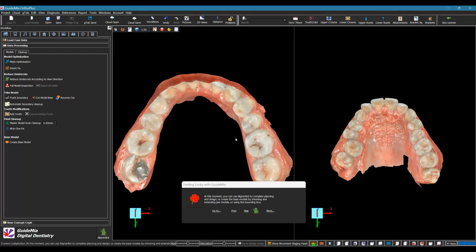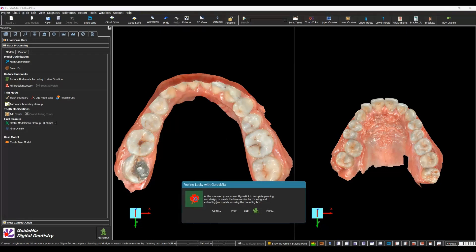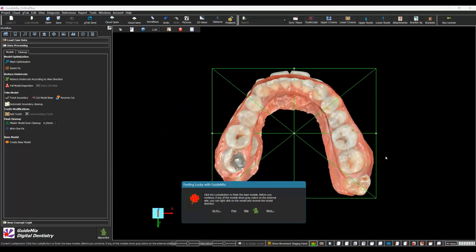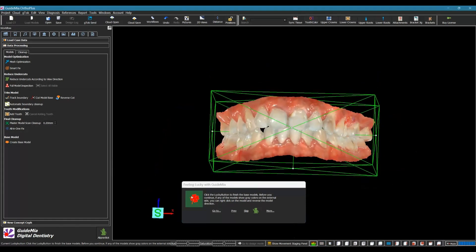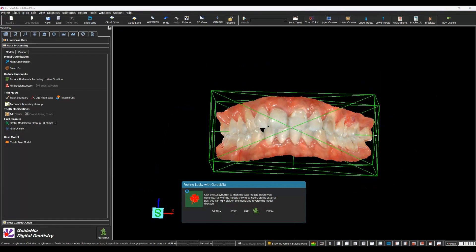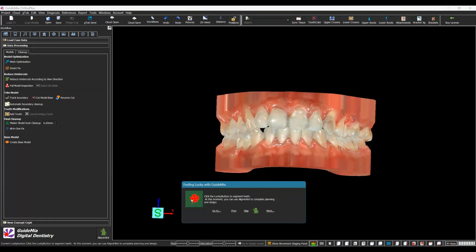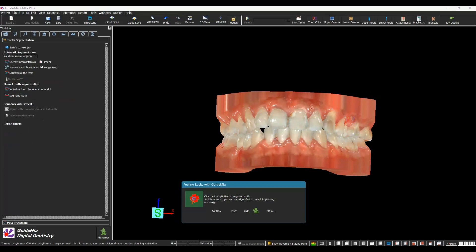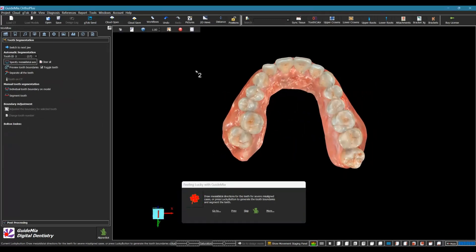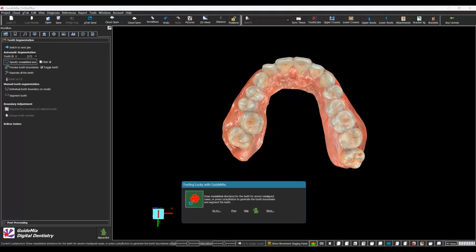At this moment, you can use AlignerBot to complete planning and design, or create the base models by trimming and extending jaw models, or using the bounding box. If you click the Lucky Button to continue with model creation, the system will automatically trim the model boundaries according to the extracted aligner boundary. Click the Lucky Button to finish the base models, then continue to segment teeth.